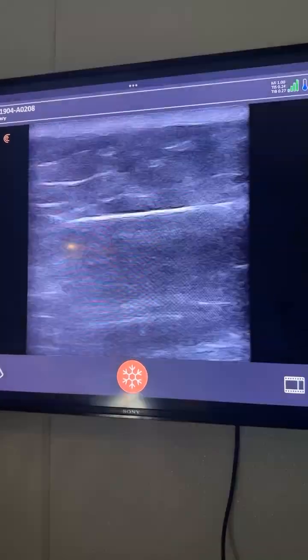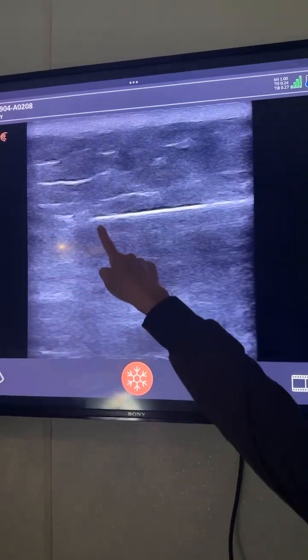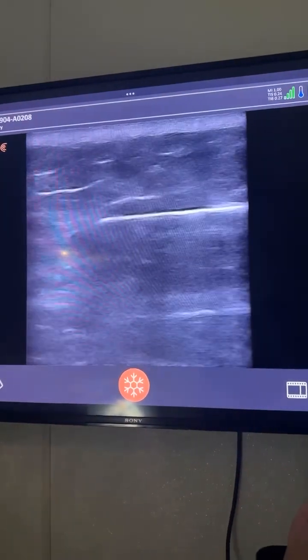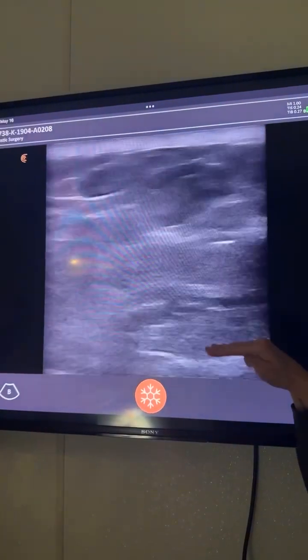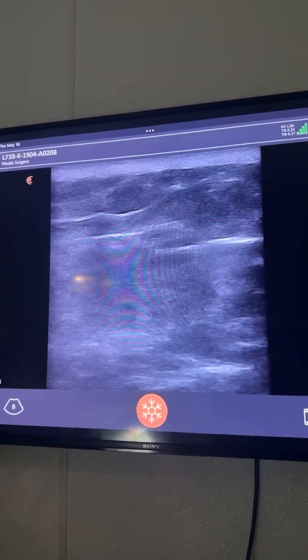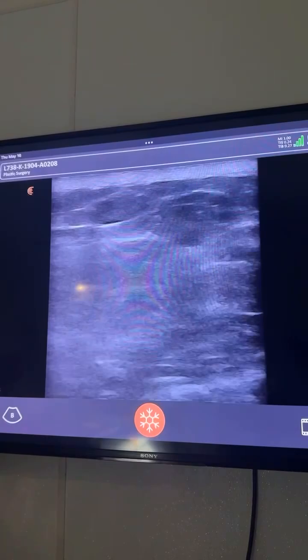Thank you. So I'm withdrawing the cannula a little bit. Why don't you point to the tip, and again, I'm going to give it a bolus. Okay, you'll see that gray stuff that's entering the area, and how the deep gluteal fascia gets pushed down, and the superficial gluteal fascia gets pushed up as fat enters the space.